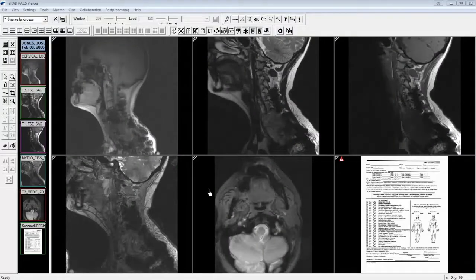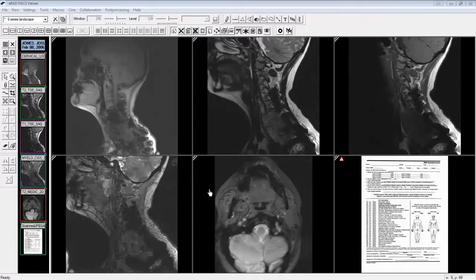Another enhancement of the eRAD PACS viewer is that the Hanging Protocol Manager has been updated. The new algorithm includes support for series equivalency. It is capable of determining when multiple series descriptions identify the same series. This increases the success rate of matching series across different studies, specifically for modalities from different vendors. Your former Hanging Protocol should work with the new Hanging Protocol Manager. However, to take advantage of the new algorithm, each existing Hanging Protocol must be resaved, overwritten, or newly created.